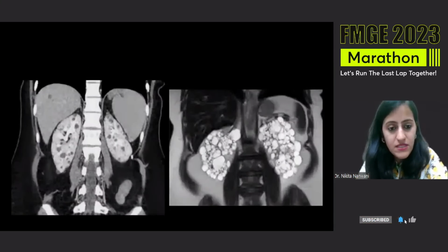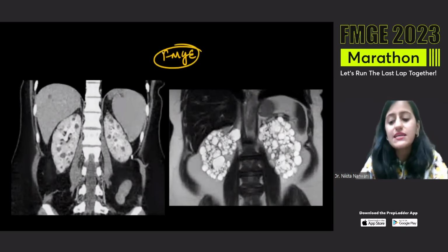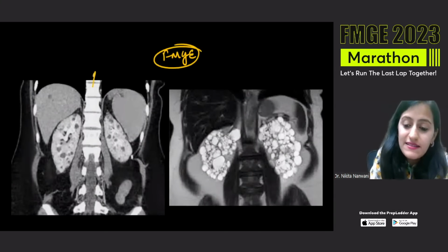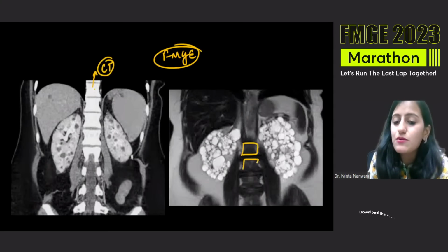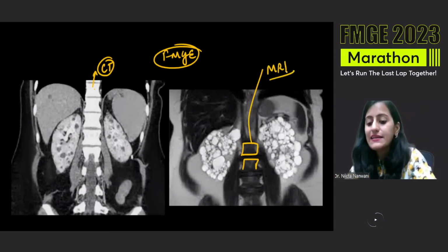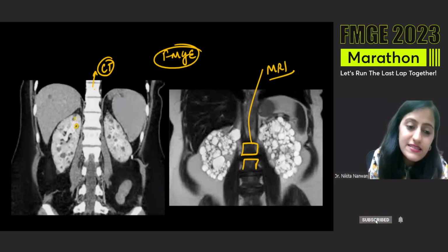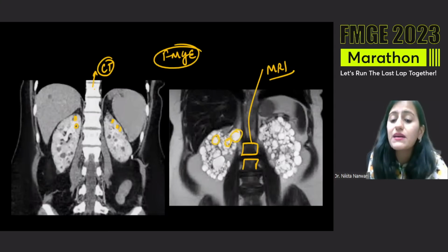Right? And this was the image asked in one of the recent FMGE exam. What do we see here? First, identify this investigation. This is CT with the white bone. This is the black vertebra. So this is MRI. So the question asked was, identify it is CT or it is MRI. Now in the CT, we are seeing those multiple small lesions, which on MRI are appearing white.